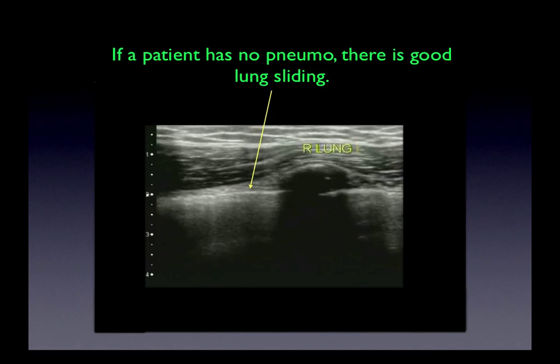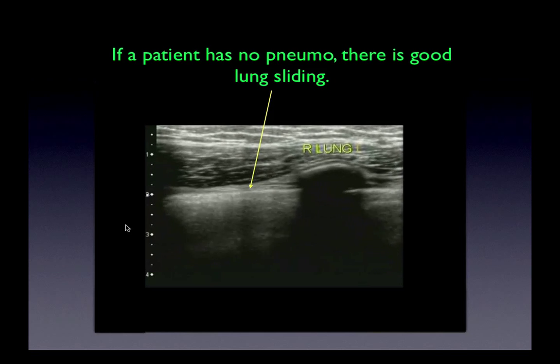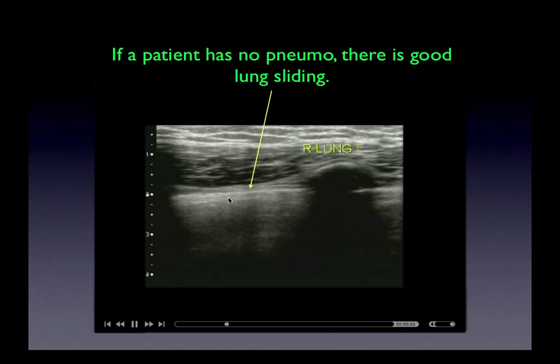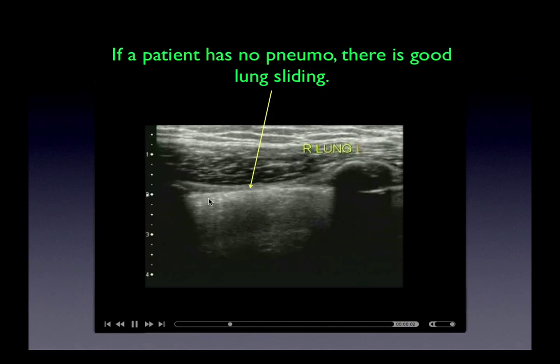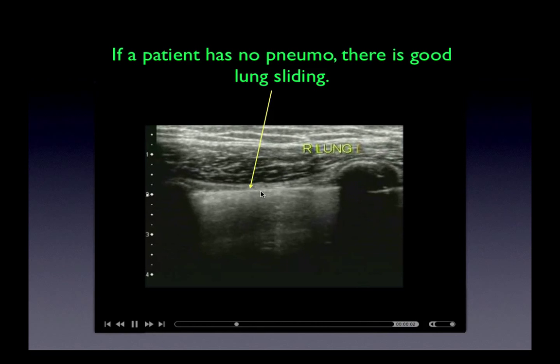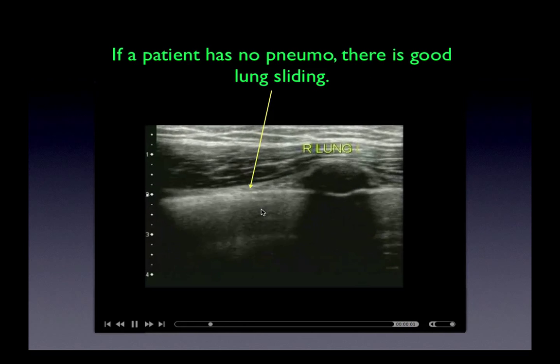Now let's look at ultrasonography as it relates to pneumothorax. If the patient has no pneumothorax, there's what's known as lung sliding. On this loop, we can see subcutaneous tissue and the interface of the parietal and visceral pleura. This line has some shimmering indicating movement, and there are lines coming down which indicate the presence of what's known as B-lines, or comet tail artifacts — all of which shows no pneumothorax.